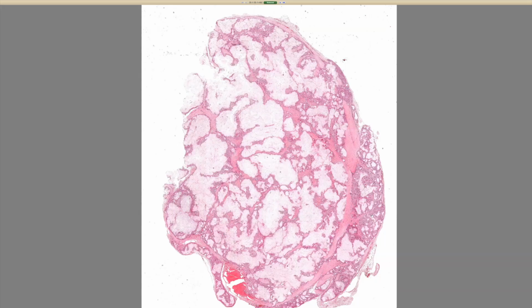What is a granuloma? Just briefly, a granuloma is a collection or aggregate of histiocytes, aka macrophages, clumped together, and they are seen in a wide variety of diseases, and sometimes because of foreign material or material from our body that's in the wrong place, deposited where it's not supposed to be, sometimes because of infection, sometimes for idiopathic reasons. Some granulomas have necrosis, or some people say caseation for that, but sometimes you have necrosis, sometimes you don't.